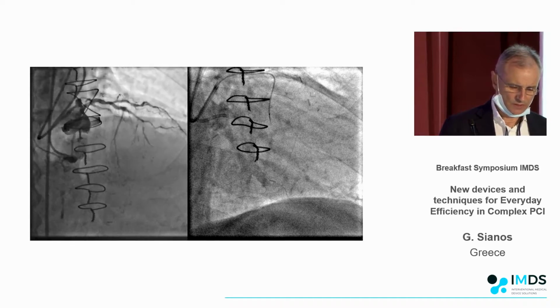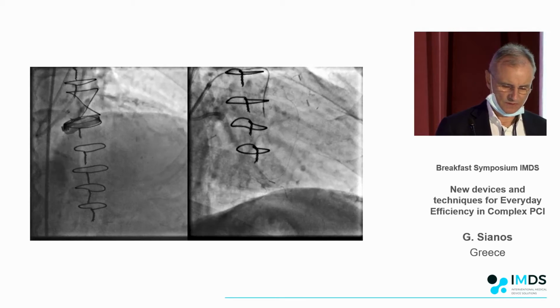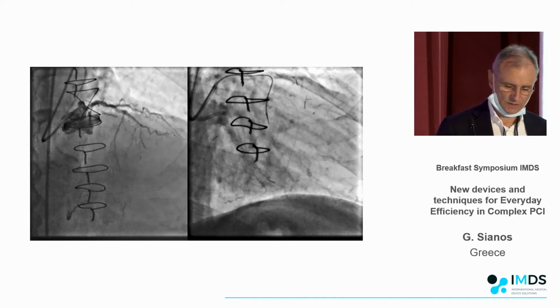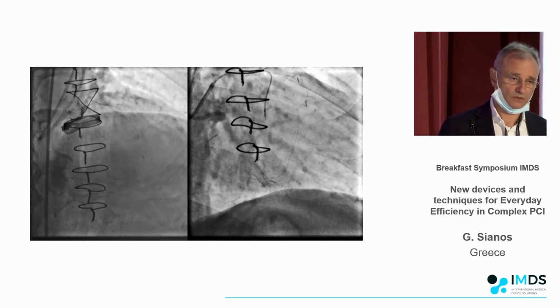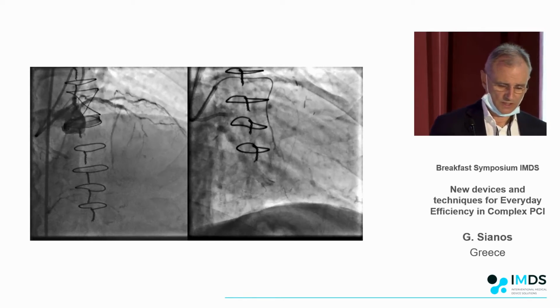And I'm going to finish by showing you another case like that. Again, these are very difficult patients. This was actually the very first case that we thought of doing it. People are now pushing the balloons completely retrograde for dilatation of uncrossable lesions for retrograde crossing. So there are many applications.